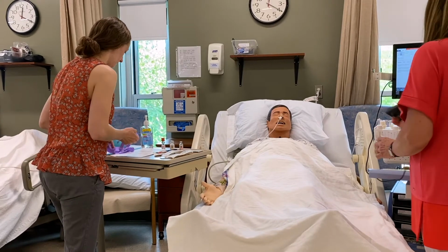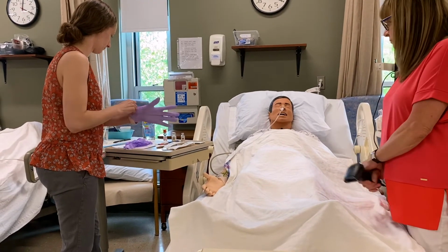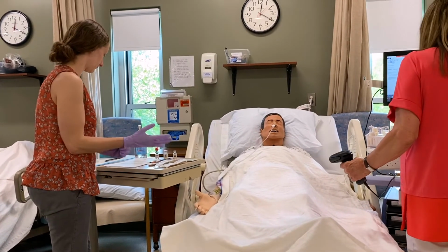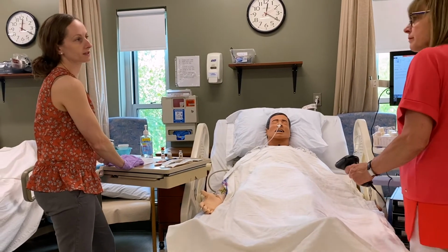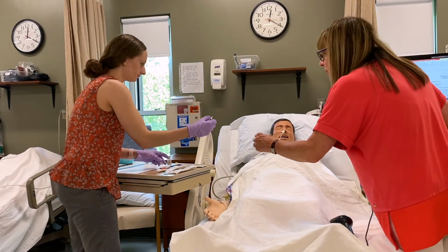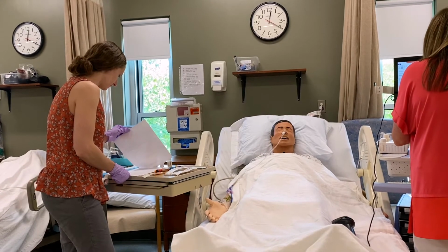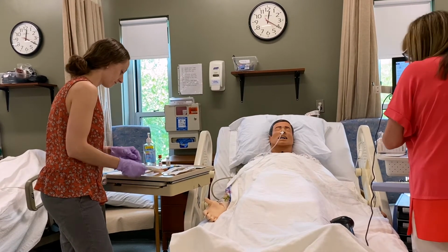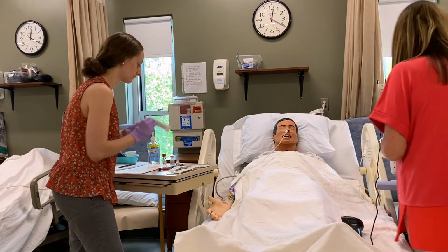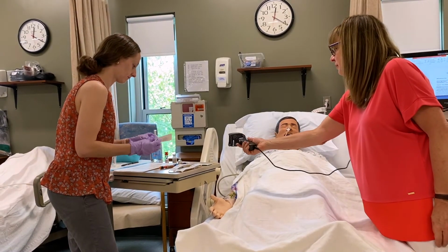So Frances, I have here today your regular insulin. How much am I getting today? So you're going to be getting 8 units. 8 units. And this is high alert, so I would need to have another nurse double check. All right. So we have 8 units. Can I check your vial, please? And the blood sugar was what, nurse? The blood sugar was 234. Okay. I'm going to select my insulin low dose syringe. Very nice. 8 units. Perfect. Let's see if that scans for you.